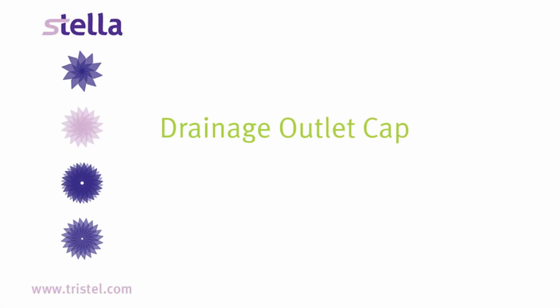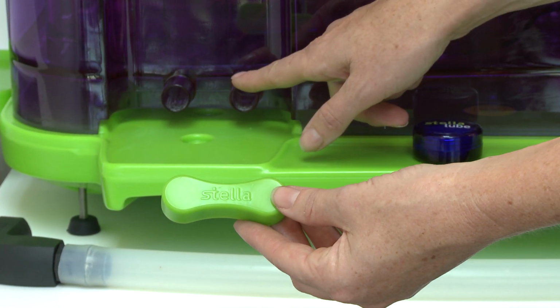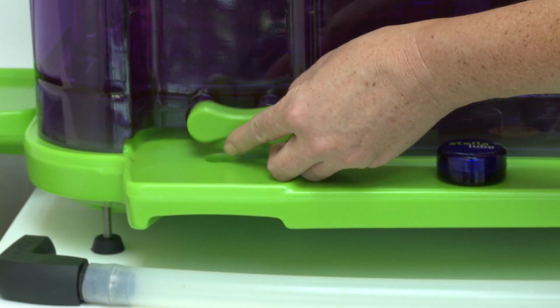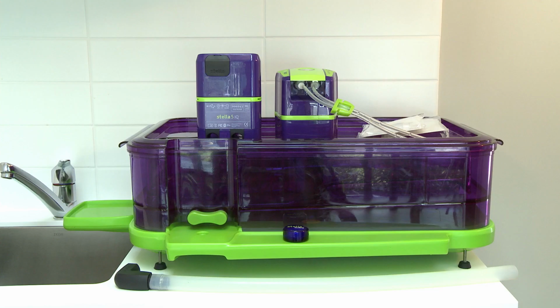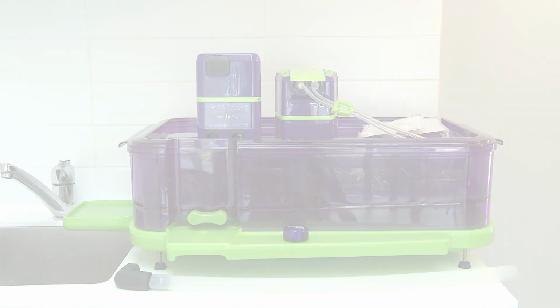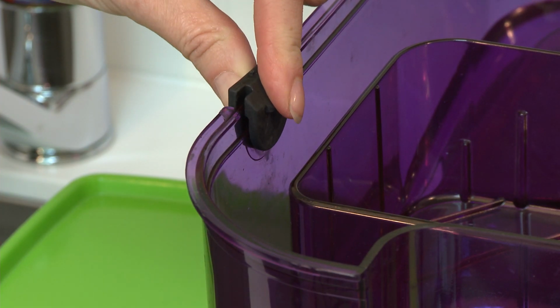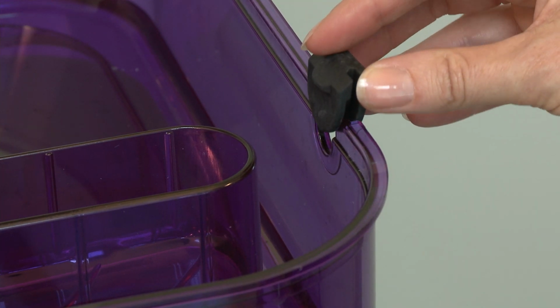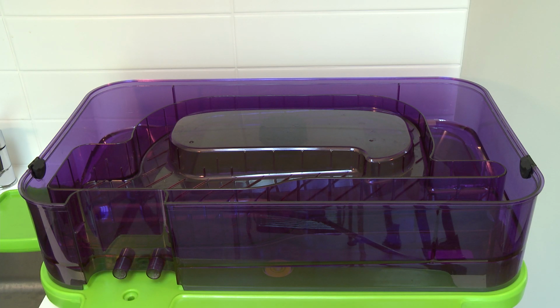Drainage outlet cap. The drainage outlet cap is attached once the base has been drained of disinfectant. It caps off any residual disinfectant when the IQ is removed from the base. Never use the drainage outlet cap on a full tray of disinfectant. Grommets. Grommets can close off the base cutouts when instruments being disinfected are fully immersed in disinfectant and no parts are exited.